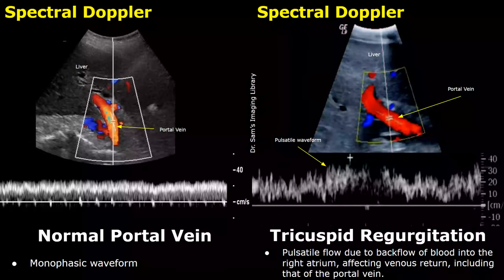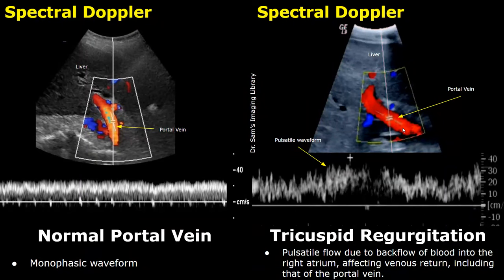This image shows spectral Doppler analysis of the portal vein in a patient with tricuspid regurgitation. On spectral Doppler, a pulsatile flow can be seen due to backflow of blood into the right atrium affecting venous return, which includes the portal vein. So in patients with tricuspid regurgitation, you may find this type of waveform in the portal vein.